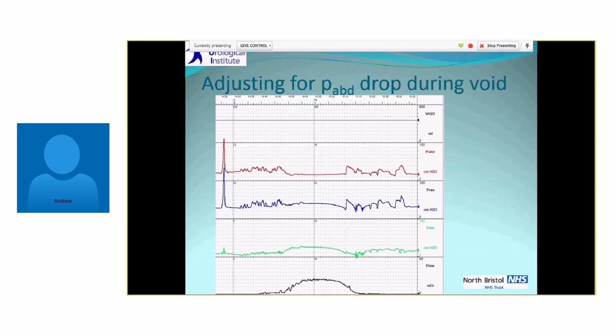Just one last item that may affect some diagnoses in male urodynamics is this artifact where you can see the values of PdetQmax and Qmax are here 25 and 26 respectively. But look up at the abdominal pressure line. At the point of maximum flow, Pabd is reading 15. But before the flow started, their real Pabd was 23.